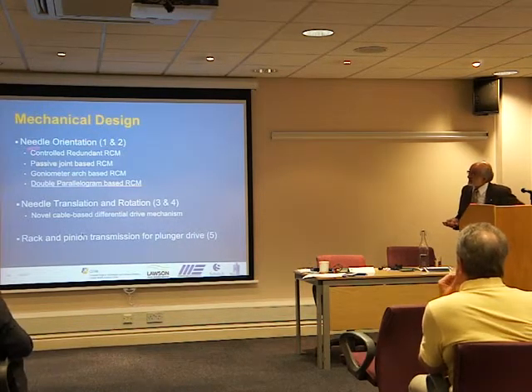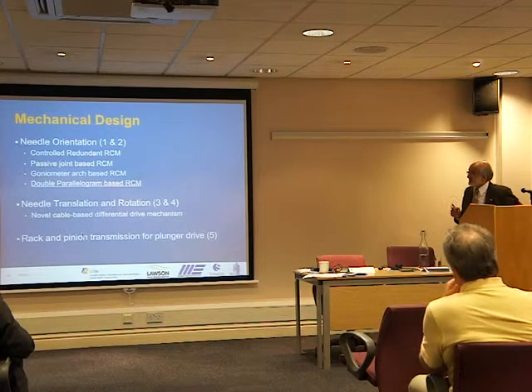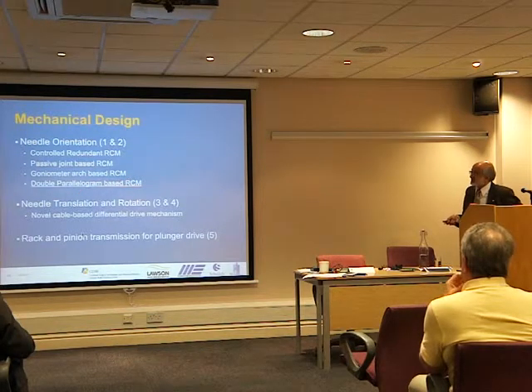Now to orient the needle at the point of entry, we need to have what is called a remote center of motion. So this is the point about which the needle is pivoted. That requires some software, or you can do it through hardware. These are 4 possibilities in hardware, and we use this approach.